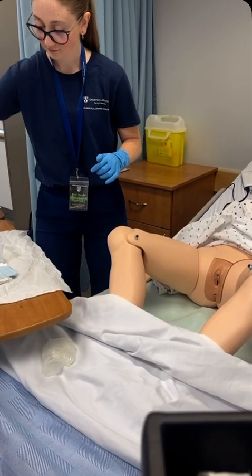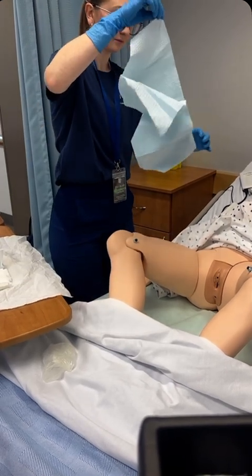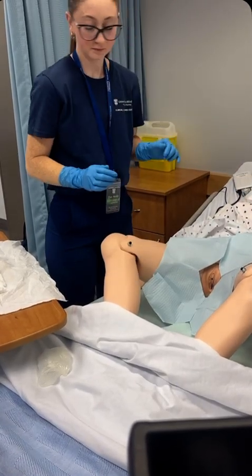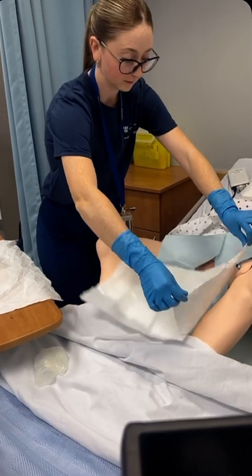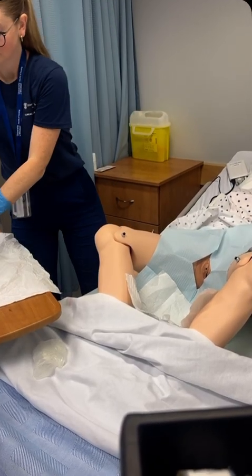Apply sterile drapes correctly, maintaining sterility throughout. Place sterile tray with contents on sterile drape.